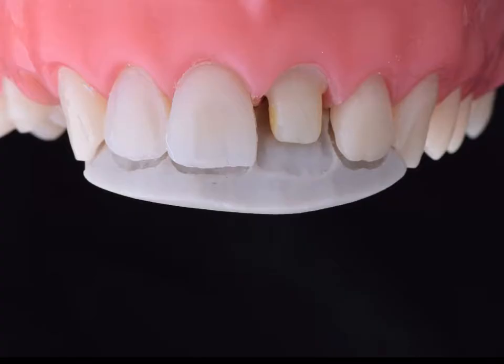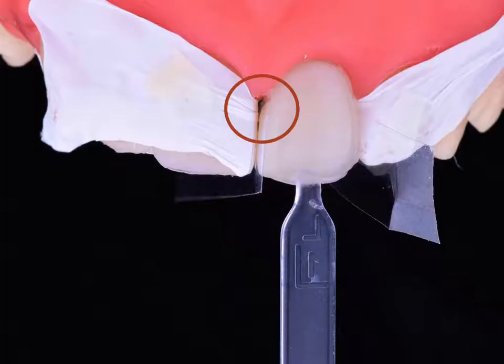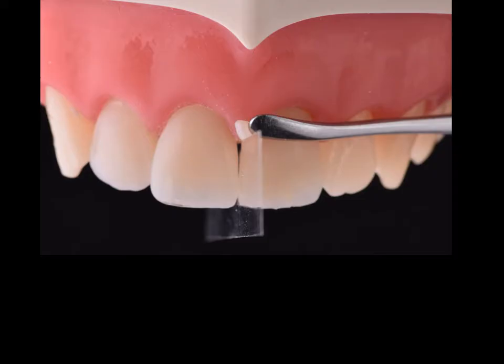Again, create the translucent layer at the back on a silicone key. Then you do the same steps of dentin shade and the enamel shade on top. But if you get some missing areas, how are you going to fix them? So I will show you how to do that. After you cure and remove the template, you will apply composite on the missing area.